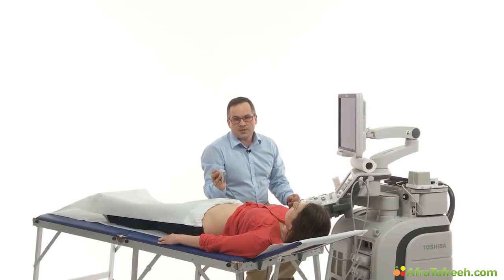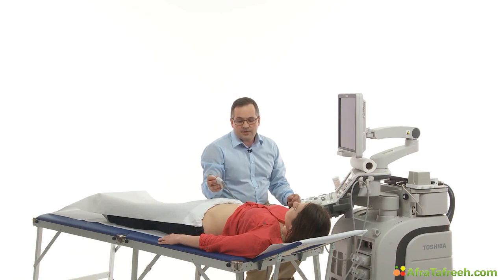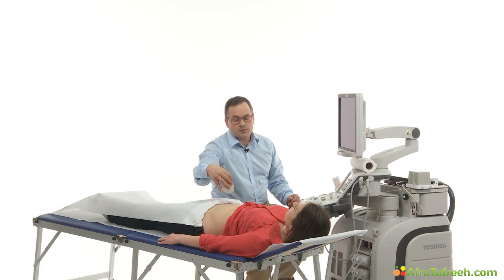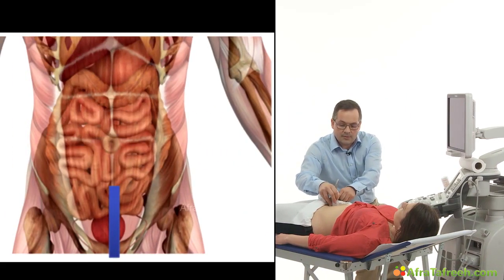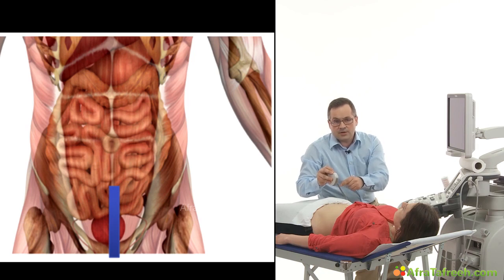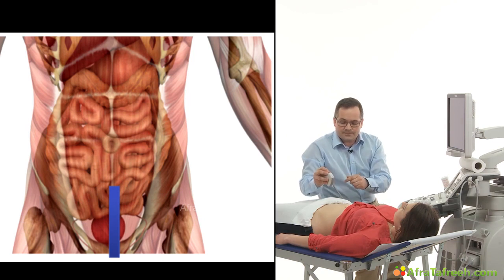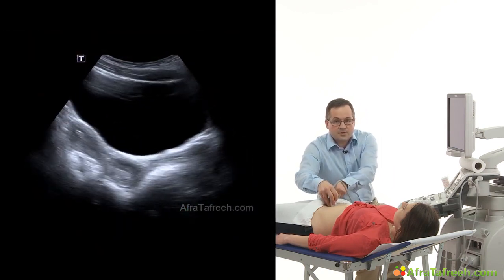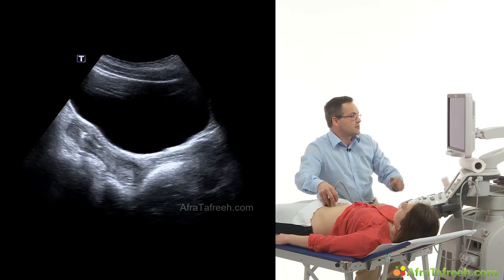So we go on with the scan of the lower abdomen in a female patient. The female pelvis is scanned in a longitudinal and in a transversal view. We start with the longitudinal view, place the probe in the midline and check the marker heading towards the head of the patient. So the nose of the marker shows to the nose of the patient. Keeping contact with the pubic bone, and we can see this lovely picture on the screen.